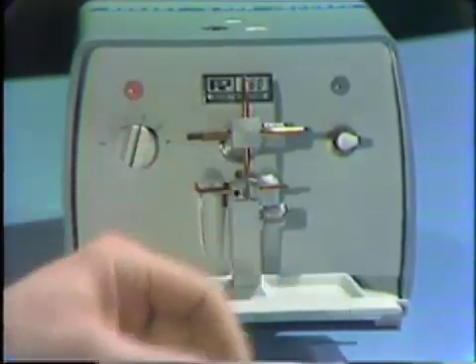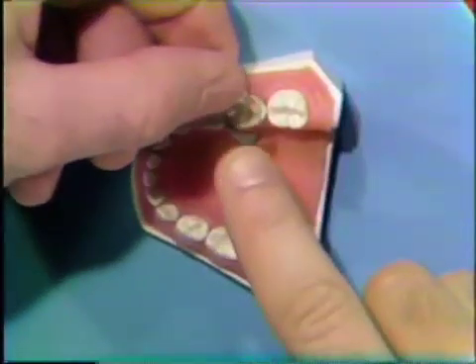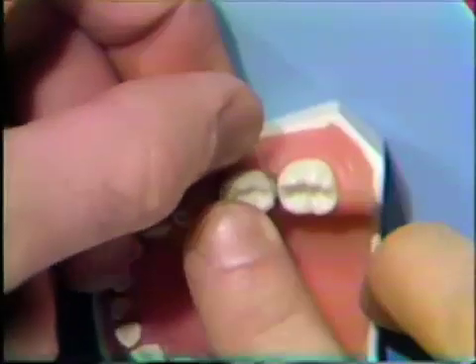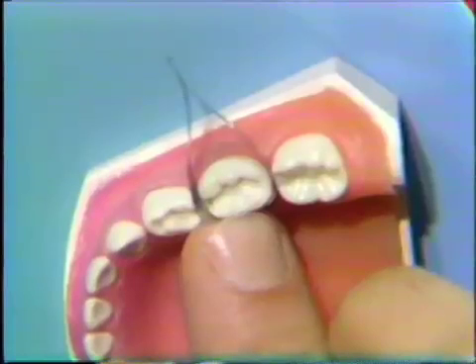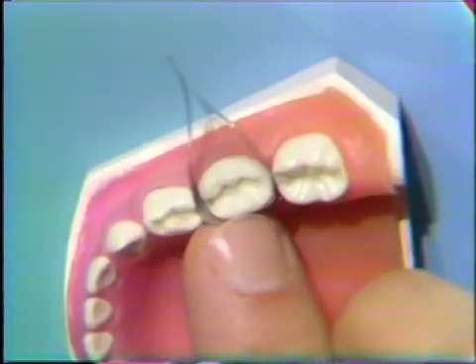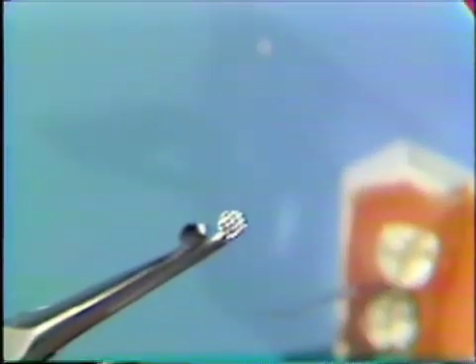Now we'll go back to the prepared tooth and adapt the band. To adapt the band, the tack-welded band is seated over the tooth and seated completely cervically. The gingival tissues in the human mouth are not quite as resilient as the rubber gingival in the typodont, and so you'll notice throughout that I'll be pushing a lot harder on the band to seat it cervically. Once the band is seated, you will use a pair of hull pliers.